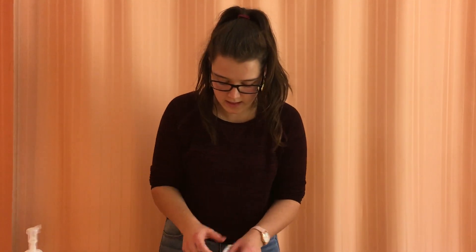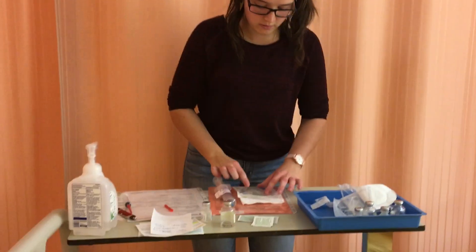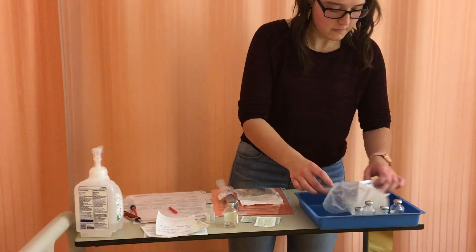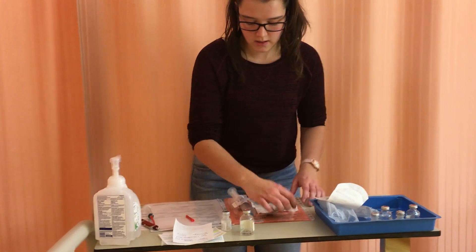I'm going to put my tag on the side that has no numbers. Now I'll take my medication, my line — which already has its tag on there for when it is done — and my alcohol swabs.